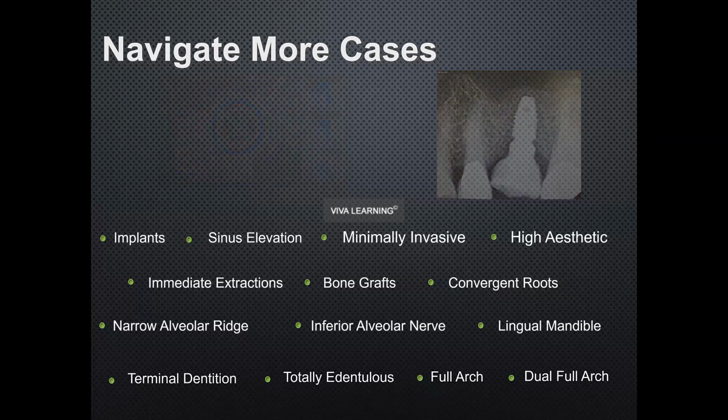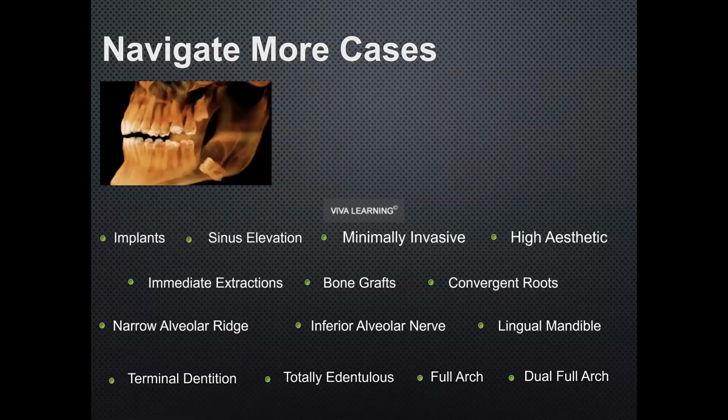Here's a case of an oral surgeon, Dr. Michael Hartman, who is doing a little off-label utilization. His research had shown him that when he's going after deeply impacted third molars, a lot of times the jaw will not have a pathological fracture when they're taking the tooth out. But when the tooth's taken out, the cyst is removed, and the patient starts eating again 2 or 3 weeks later, and he thinks everything's fine, they'll then notice a fracture.